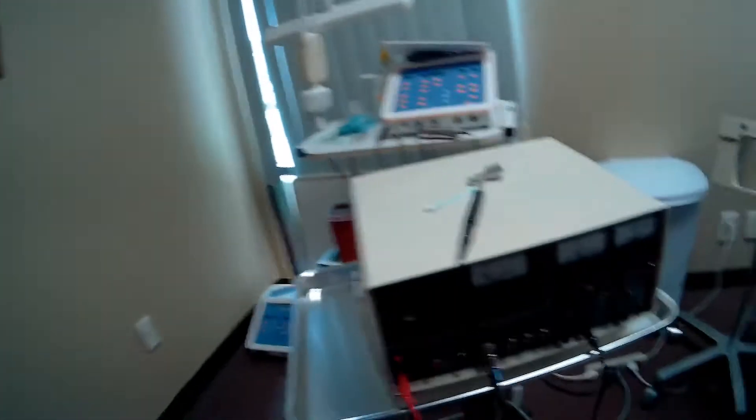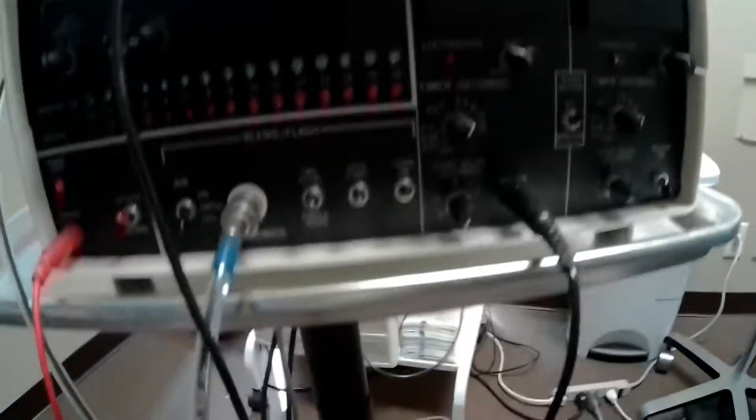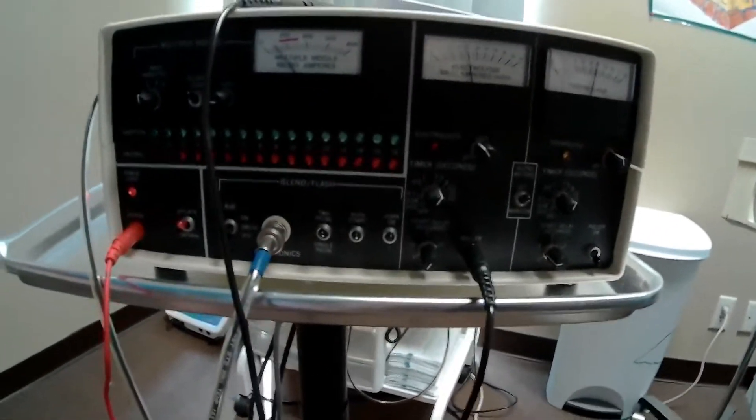Hi guys, just here with one of my students, and she brought in her own electrolysis machine, and it's a new learning experience for me. My mom has worked with these machines before, but this one is, as you can see with the technology, it's just a little bit older than what we're used to dealing with. But that's okay because it's a good learning experience, and I'm actually going to let my student work on me with this machine. I love when my students work on me because it's a good learning experience.